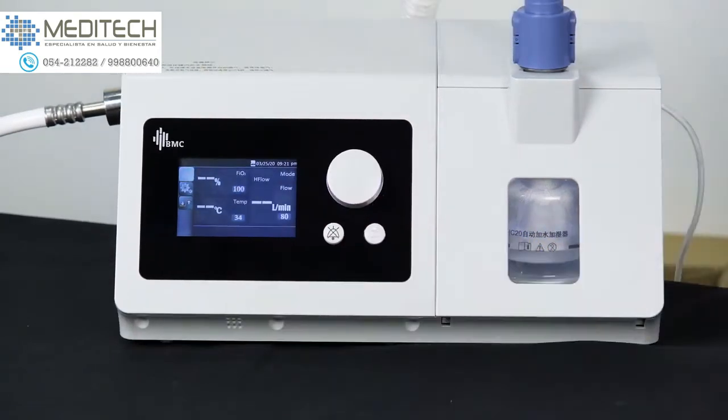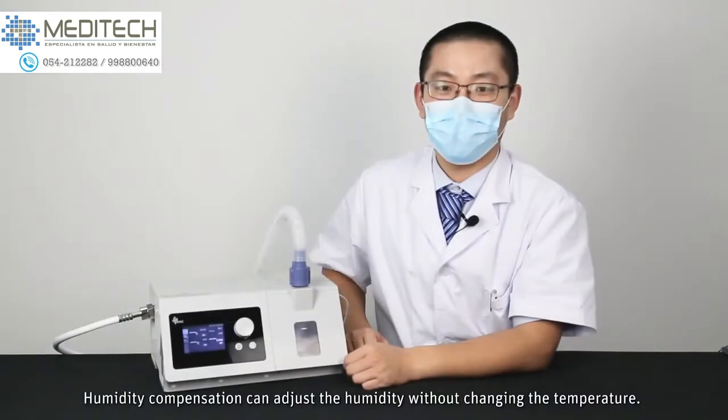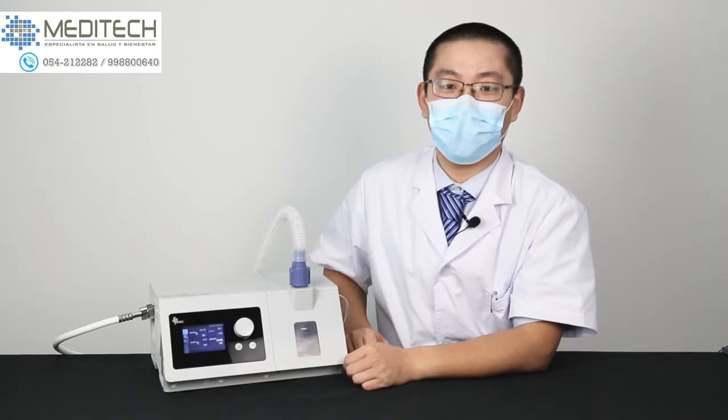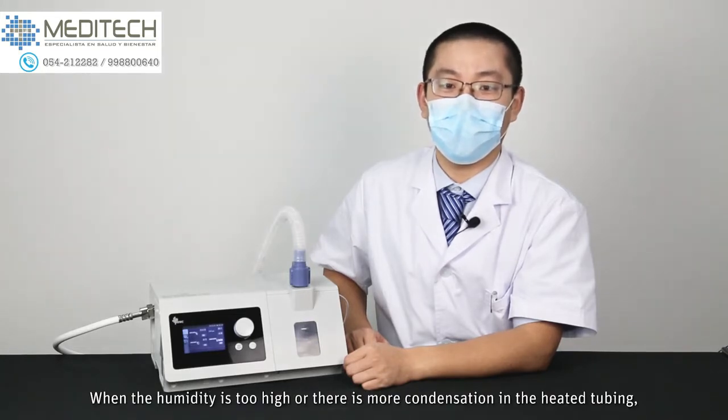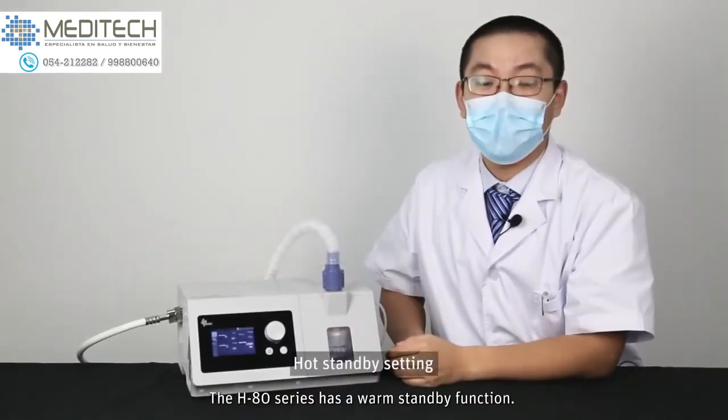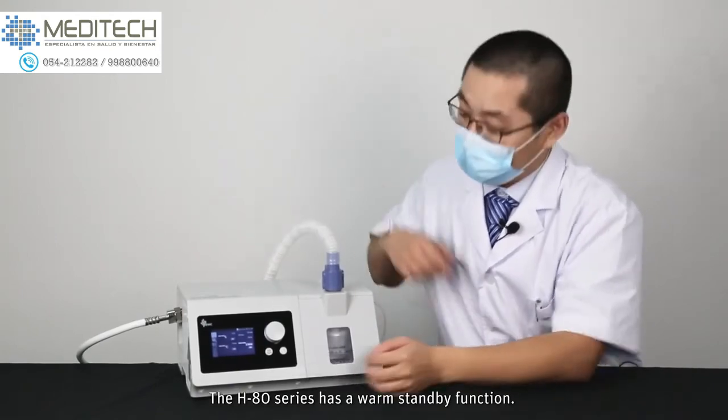Rotate the knob back. Humidity composition can adjust the humidity without changing the temperature. When the patient feels that the humidity is insufficient, increase the gear number. When the humidity is too high or there is more condensation in the heated tubing, the gear number should be lowered.